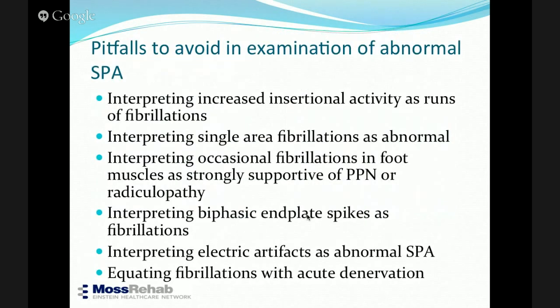So pitfalls to avoid: interpreting increased insertional activity as runs of fibrillations or positive waves; interpreting single area fibrillations as abnormal, I see that sometimes; interpreting occasional fibrillations in foot muscles as strongly supportive of a pathological process, because an occasional fibrillation may be present in about 3% of the population in foot muscles.